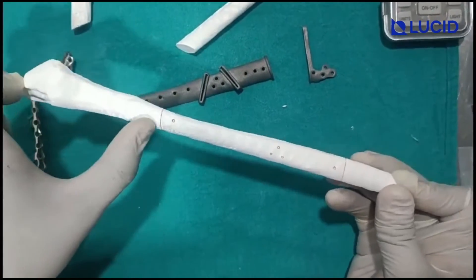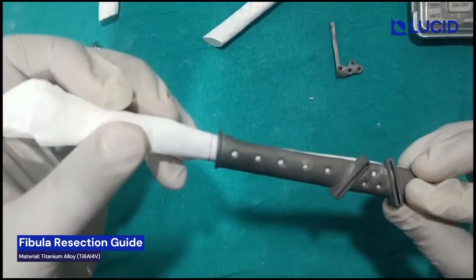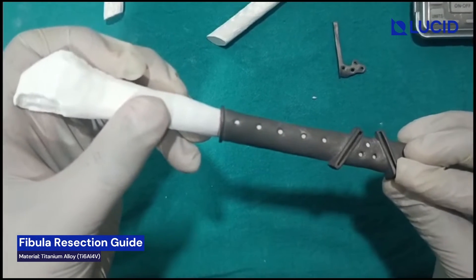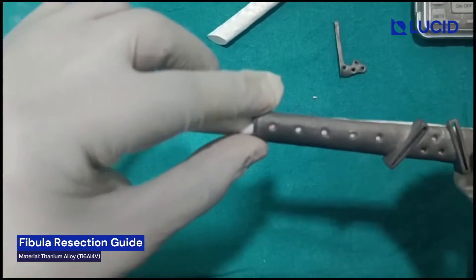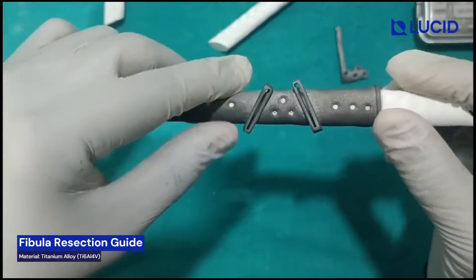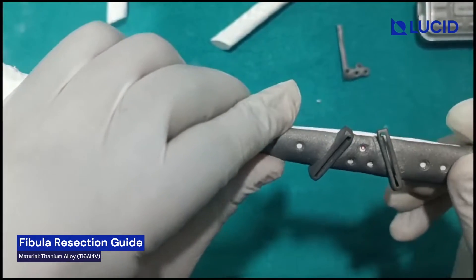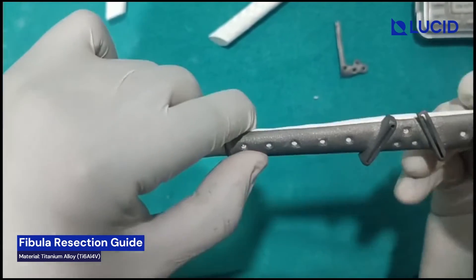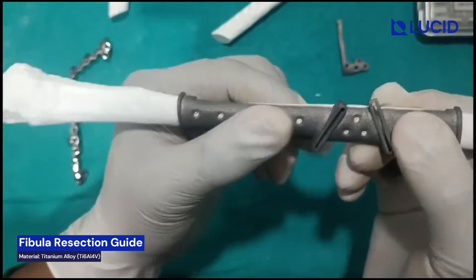From the ankle, around 8cm at a distance, this guide will be fixed. You can see I have done the markings — this will be getting fixed like this. So this red line will come here and this hole will also come here. Three holes are marked in red and again this red line. So you have to fix in this fashion, so you know exactly where the guide is going to sit.